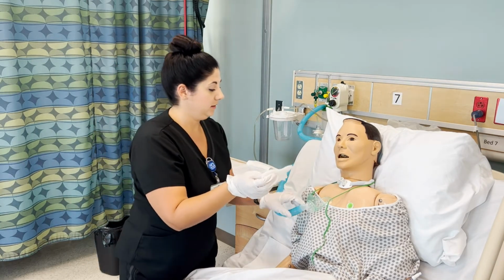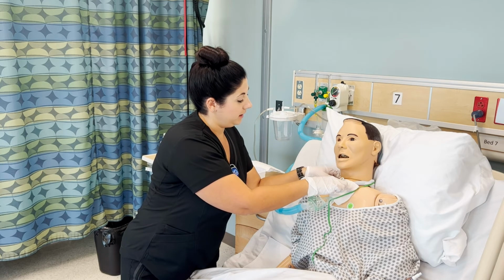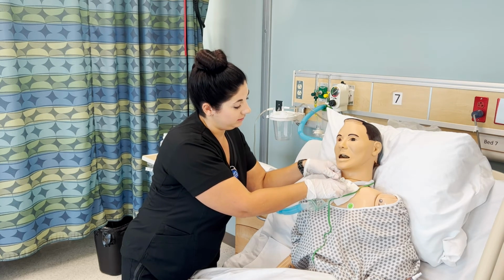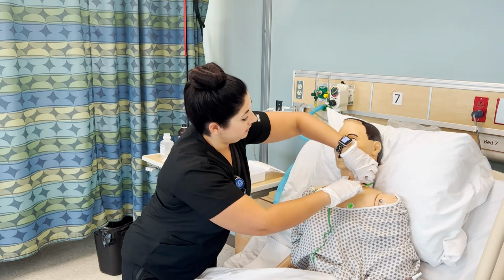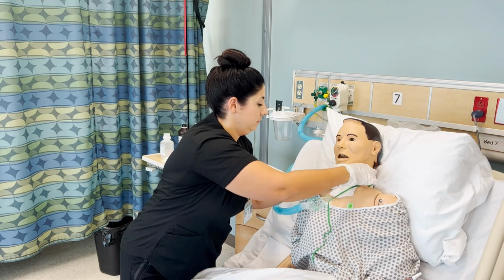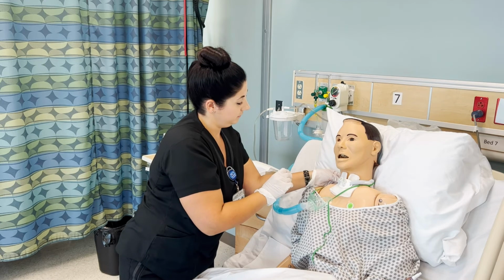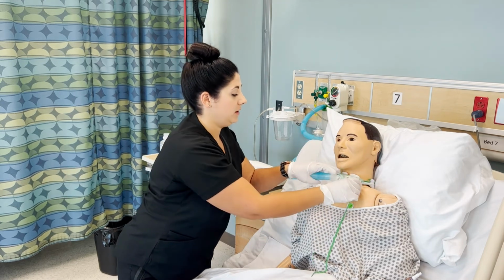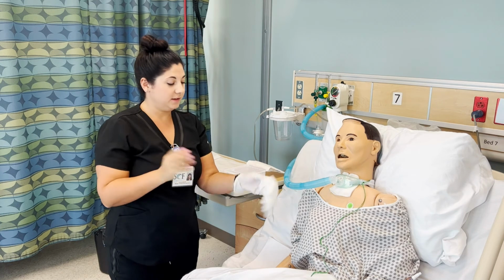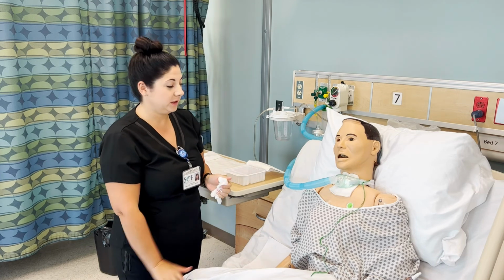And with your sterile hand, move this out of the way. We'll place the new dressing. And at this point, just try to maintain as much sterility as you can, but you can loosen these trach ties if it's hard to get it underneath. And scoot that right under. Tightening them up before you're finished. Replace your oxygen mask. And then you'll take off your gloves, wash your hands, get rid of all of your trash, document the procedure, and remember your patient's safety by lowering the bed and raising the side rail.